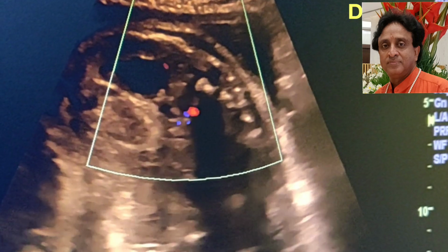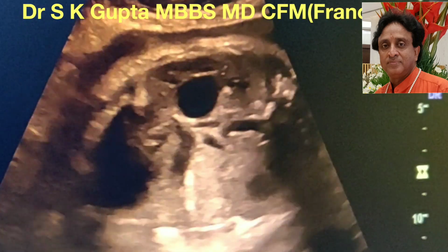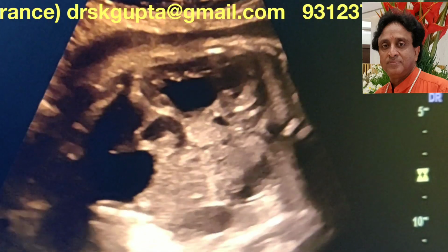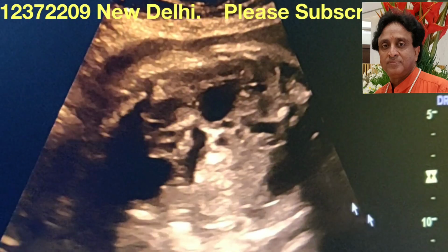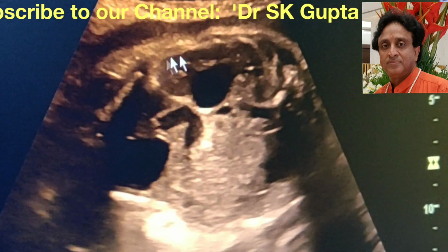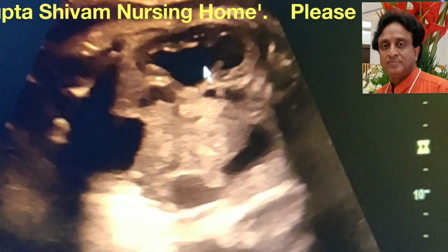Now I am going to turn my probe to the perpendicular direction. I try to make a coronal section of the fetus. This is the coronal section. I turn my probe. This is the kidney. You can see the kidney in the coronal section, and the whole renal pelvis seems to be dilated and filled with fluid.